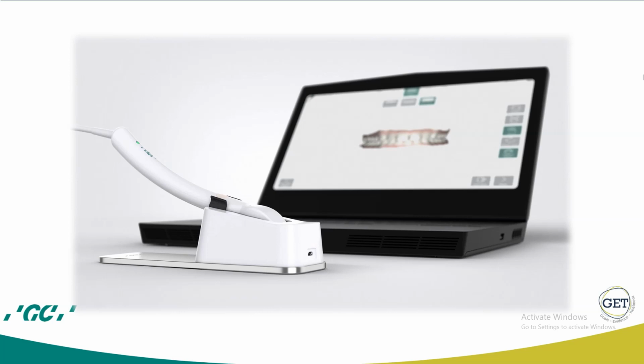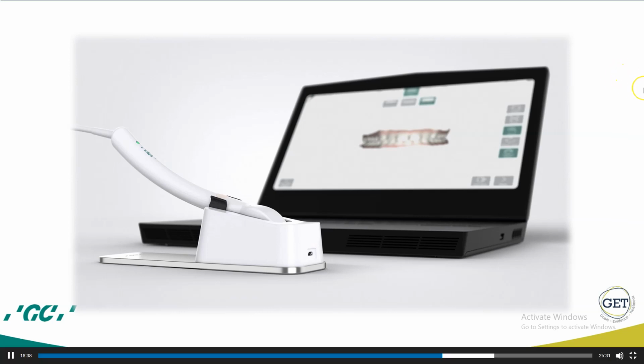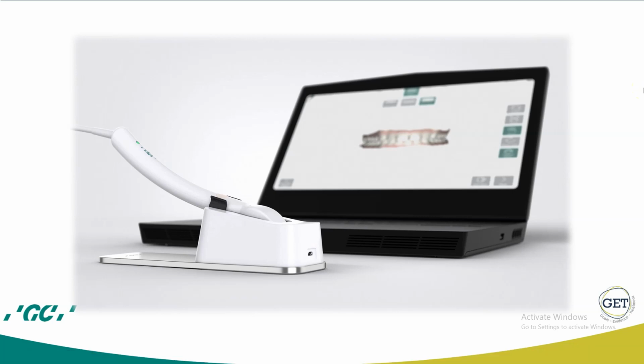The cradle. The cradle for the application device for scanning is an open case for the placement of the handpiece in resting position. It contains a heating plate responsible for maintaining the temperature of the glass plate at the head of the handpiece in order to avoid fogging when used in the mouth. It is connected to the PC with the USB cable.